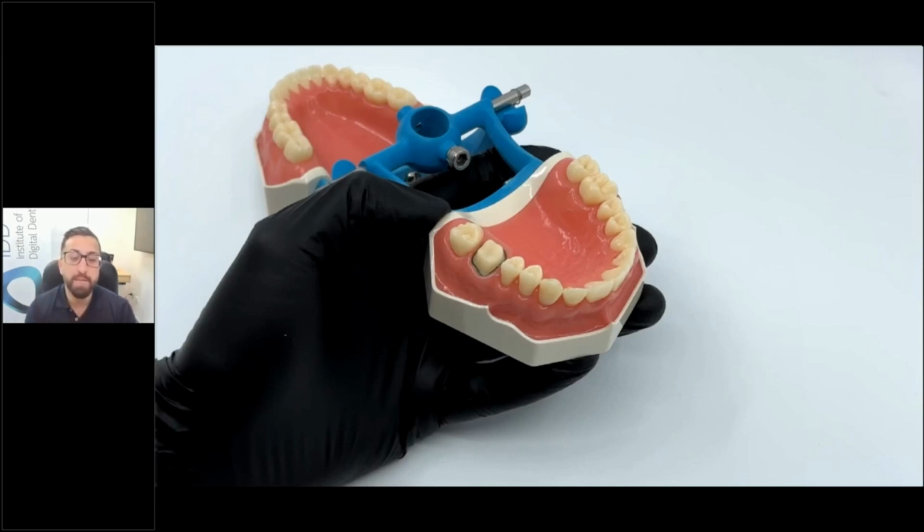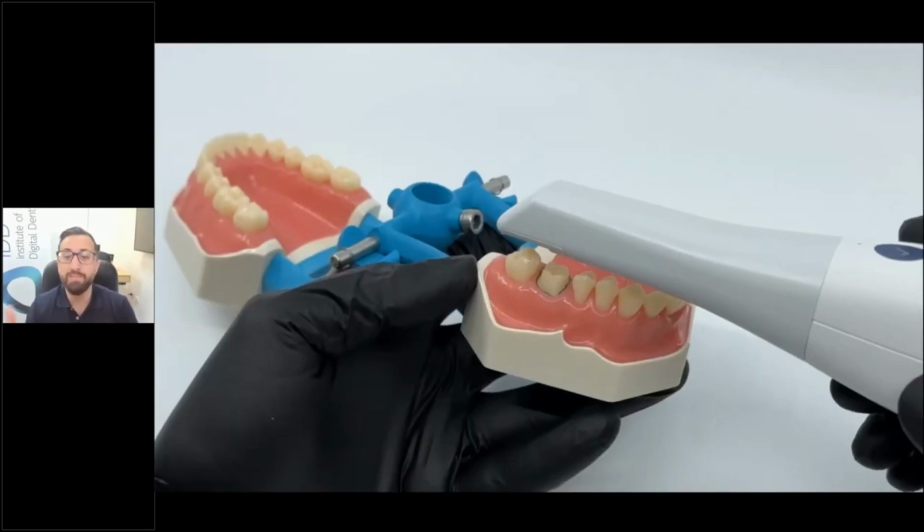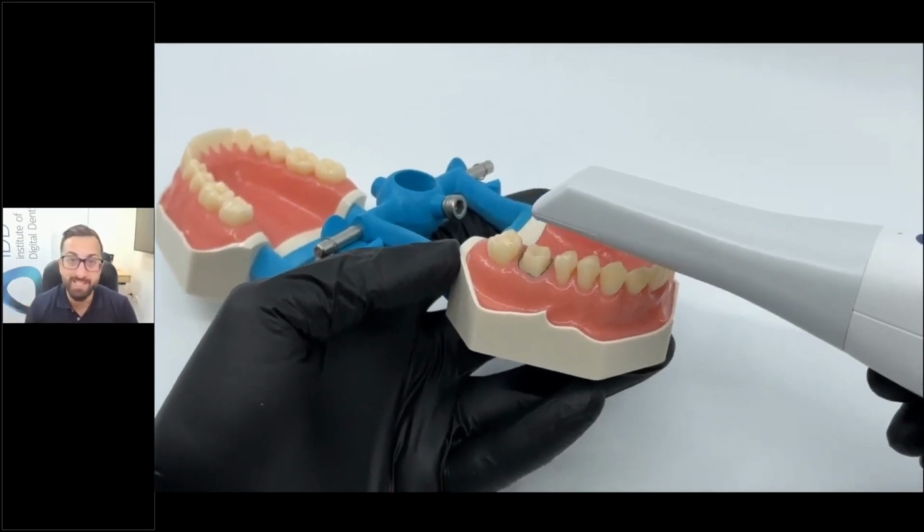I recommend you scan overall. You follow the strategy, occlusal, buccal, palatal, and then you go back and fill in the areas that you need to. Typically the areas that you need to fill are around the contact areas, for example, around your preparation. Now you will see that is a full arch scan. You can also equally do a quadrant scan, and I will leave this for you and your lab to discuss.